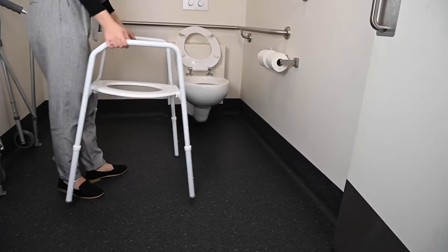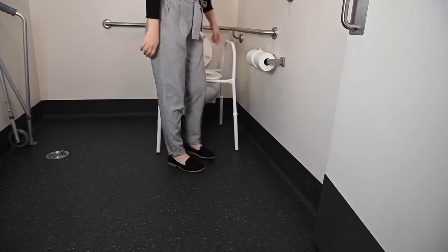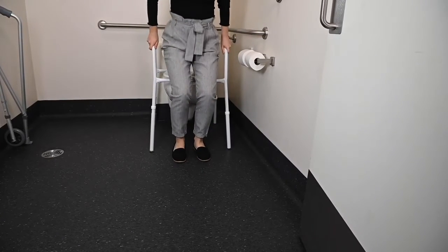Over toilet frames are used to increase independence and ensure safety when transferring on and off the toilet, by adding height and providing handrails so that you are able to transfer with the support of your arms.